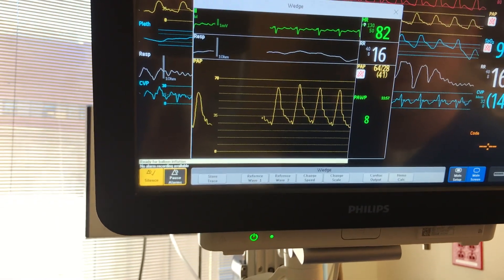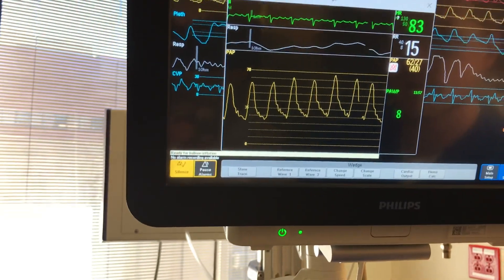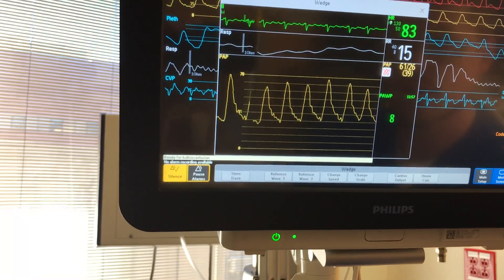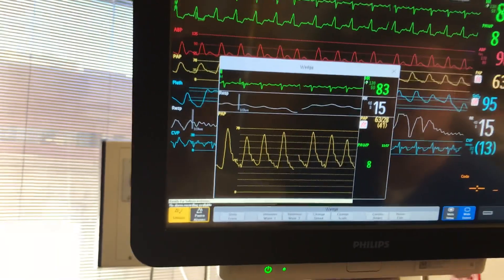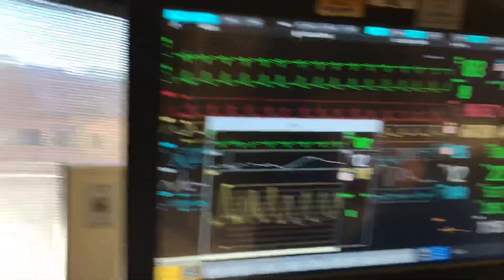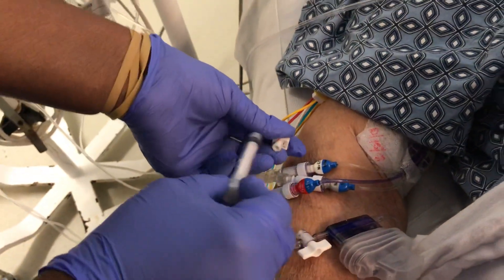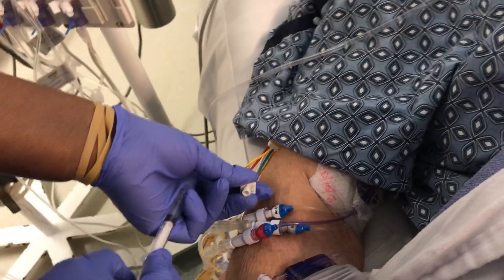Because on here, as soon as it started to wedge, I hit store tracing, and then edit from there. Let me do it one more time, see if we can get it. Just one more. You don't want to be doing it all the time. You just don't really want to leave the balloon up for more than like five seconds.